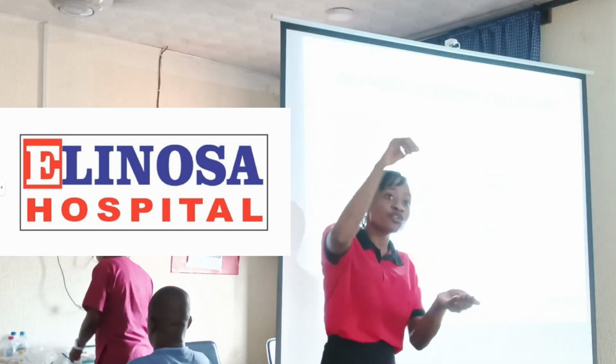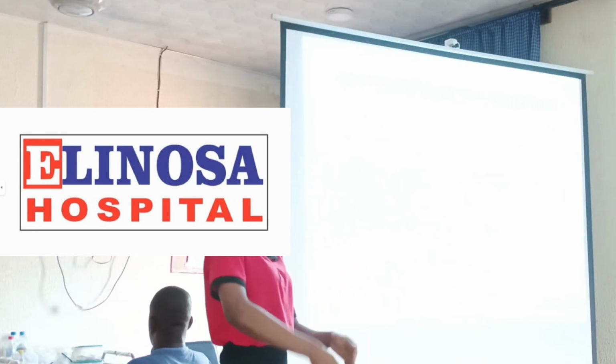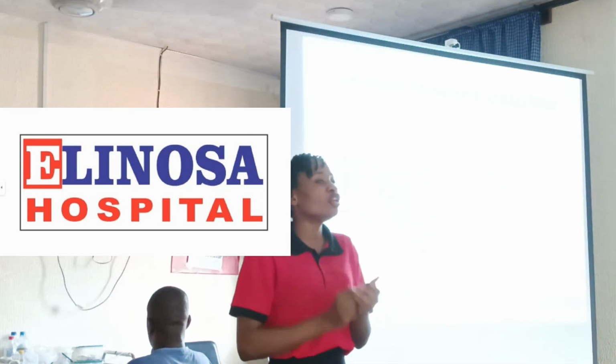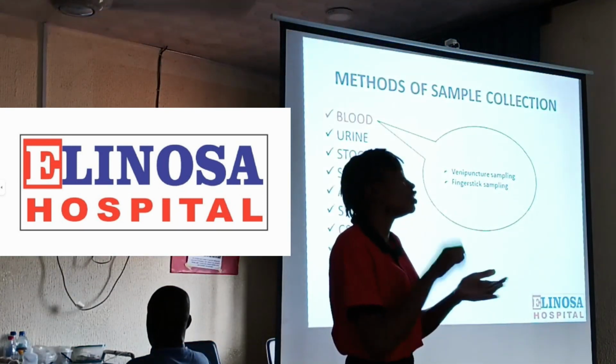The patient should not fill the container with the stool, because some patients will feel that the more they bring, the better. Tell them to just take a little portion of the stool that they have passed out into the container.